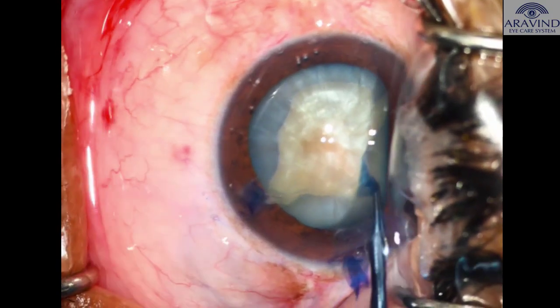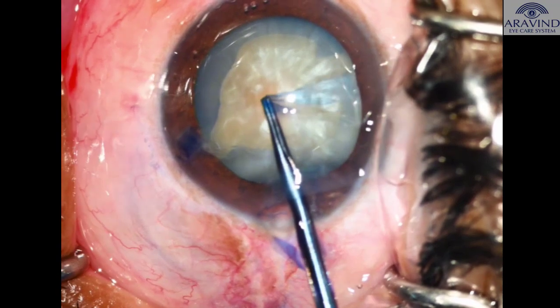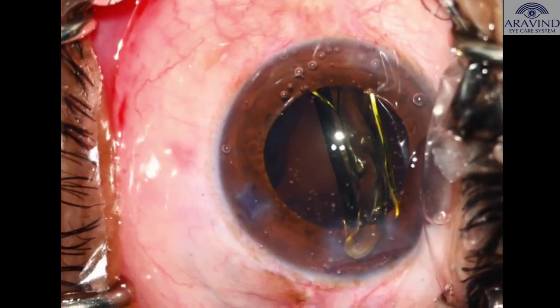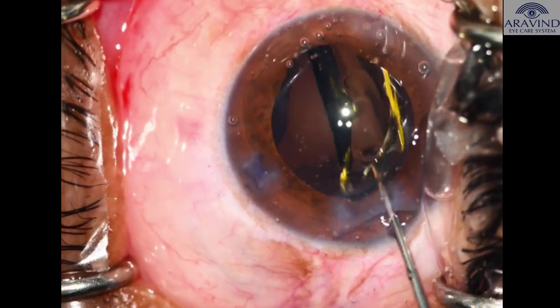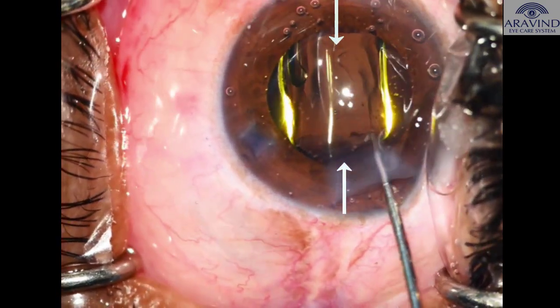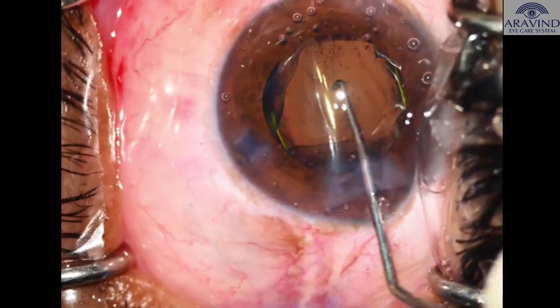The intraocular lens is implanted perpendicular to the tear, here at the three o'clock and nine o'clock axis, to provide better stability to the bag.